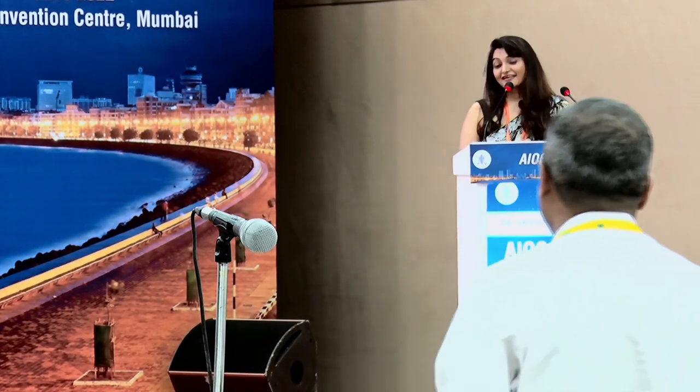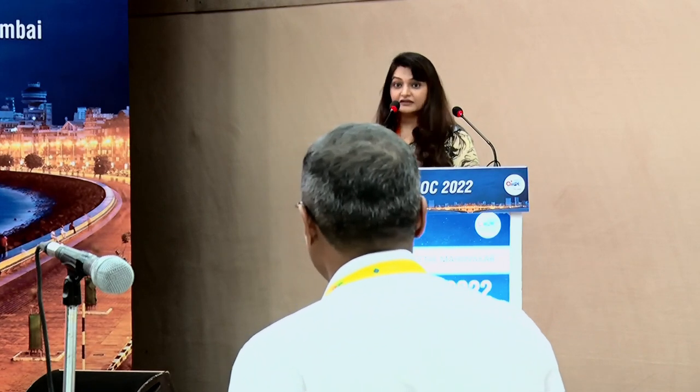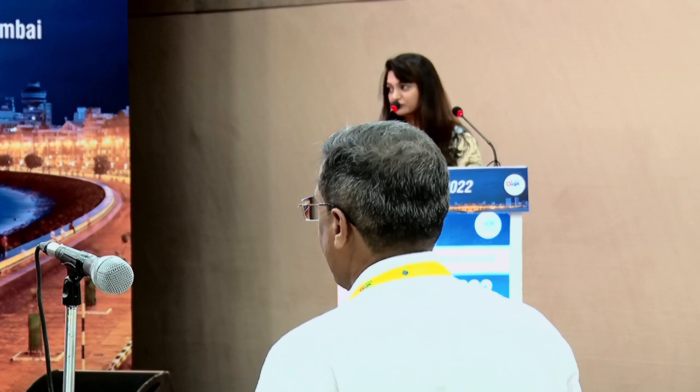See, surgeon can... At that point in time, I actually thought that it was fibrous capsule, but I may need to actually go and see the full video, this is still an edited video, and review it, and what she said may be true. But at that point in time, I thought it was, because whatever I had removed was very, very thin, papery thin thing. So I don't know whether that was capsule or not. I'm still not very sure about it. If it was a subcapsular fibrosis, then I think it should easily be removed by phaco, and it should not require cutting.